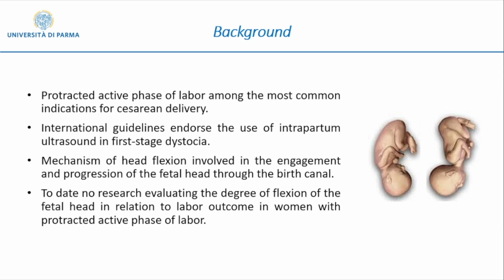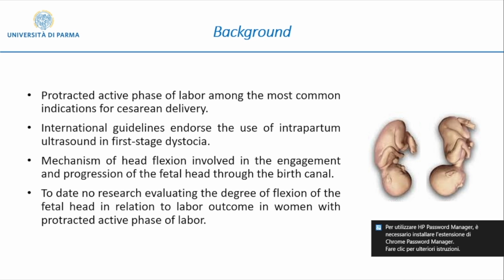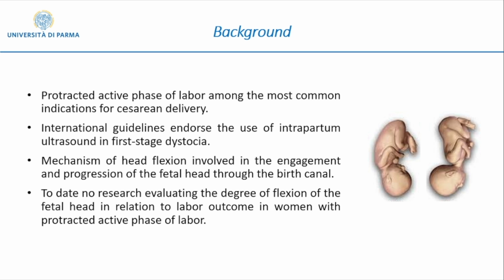Looking at the mechanics of human labor, we know that the flexion of the fetal head is involved in the engagement and progression of the fetal head through the birth canal. However, to our knowledge, no research has evaluated the sonographic assessment of the degree of flexion of the fetal head in relation to the labor outcome in women with protracted active phase of labor.